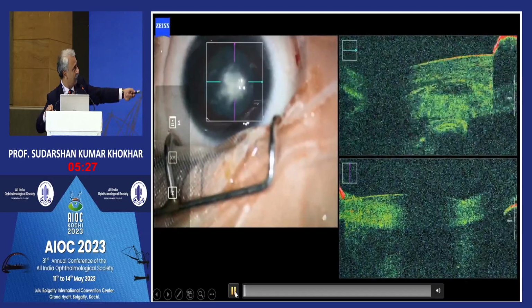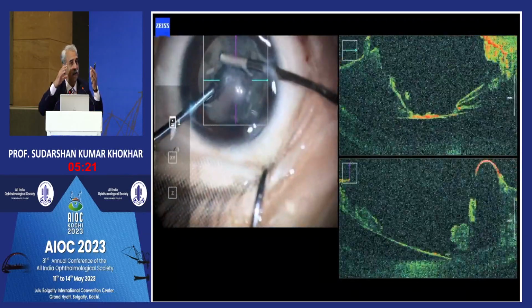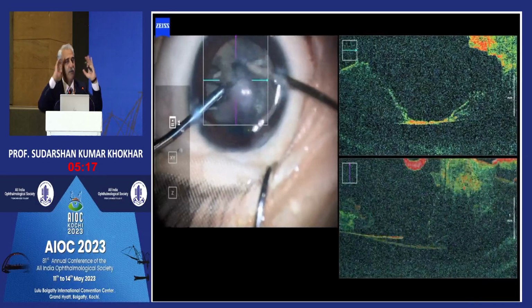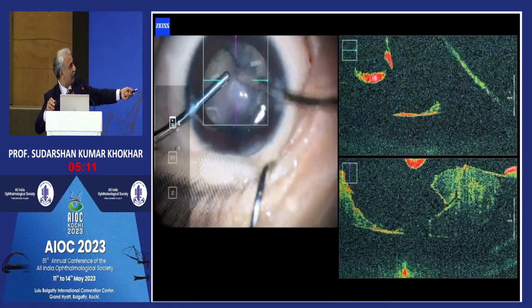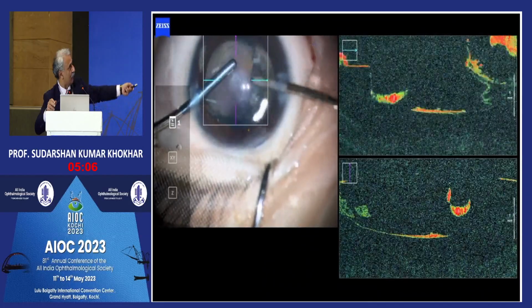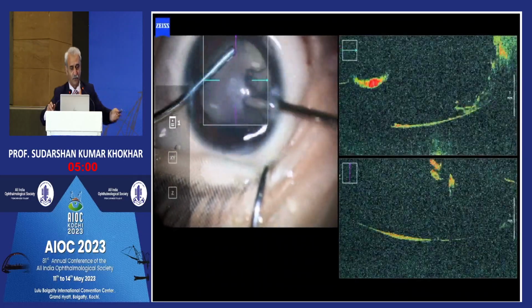You can see the morphology up here. So this is not a typical zonular lamellar, because you can see there's a little more translucency in the periphery, and the central part is much denser. Whereas the lamellas normally have a consistency all around. You can have a central lamella, central nuclear also, but this was the different thing. So that you can pick up on that one. So along with the surgery, when it's going on, you can pick up, and you see there's a membrane at the back, which is seen right now here, and you can see the reflection on the back. So no big deal, you can see it otherwise also.